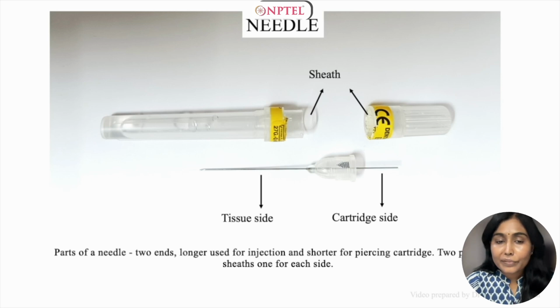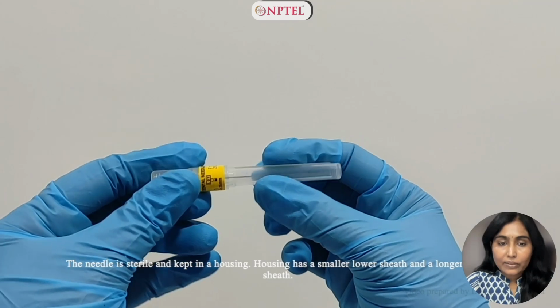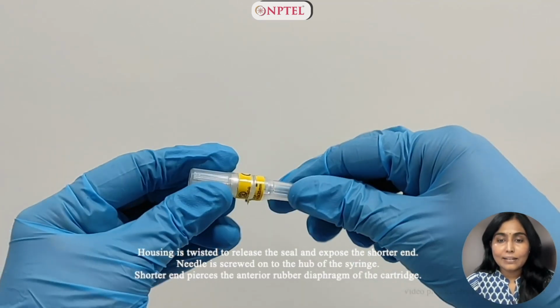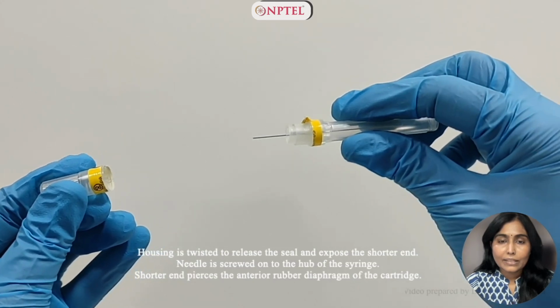The needle consists of two ends. The longer end is used for injection and the shorter for piercing the cartridge, and both the parts are completely sheathed. The needle is sterile and kept in a housing. The housing is twisted to release the seal and expose the shorter end first. This is how it is done.